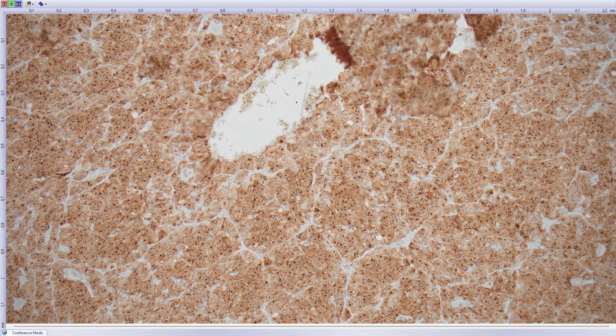It can be irregular or even with focal negativity. So it is not easy to read the immunohistochemistry in case of a TFEB amplified renal cell carcinoma. Focal positivity doesn't mean that it is not TFEB amplified renal cell carcinoma. GPNMB is a very good marker, but it is not 100% sure about the diagnosis. So this was TFEB translocated renal cell carcinoma.